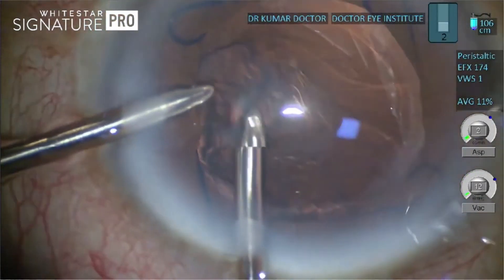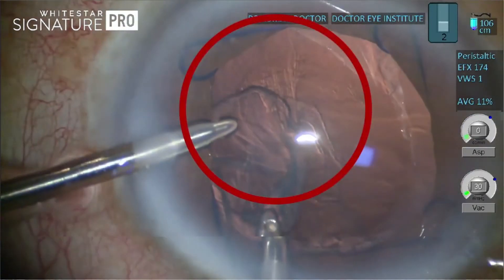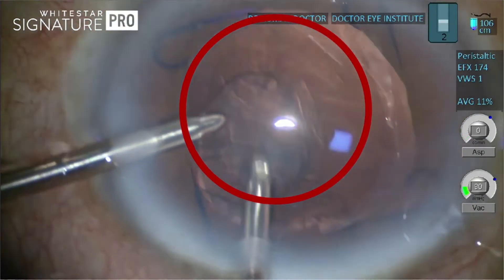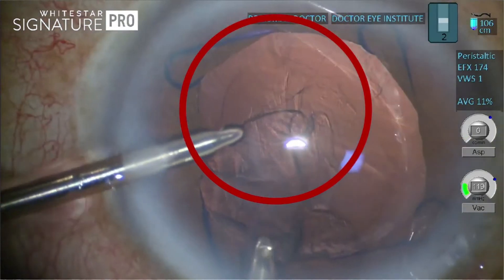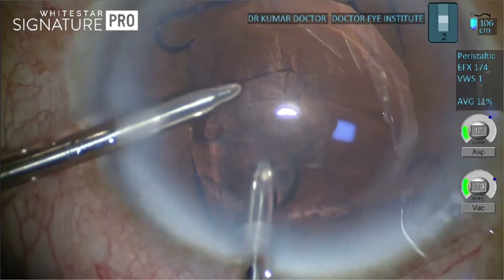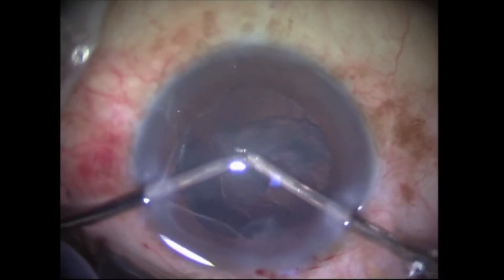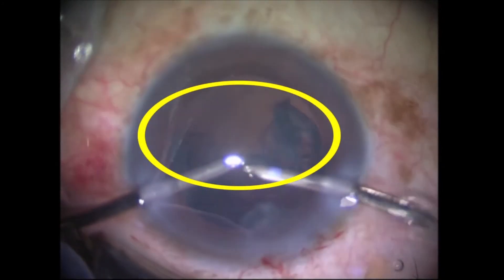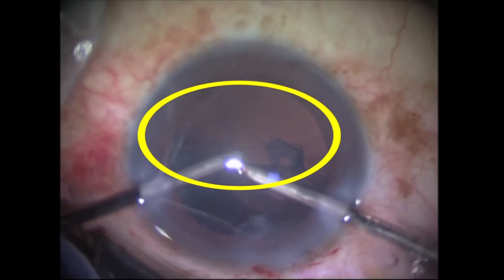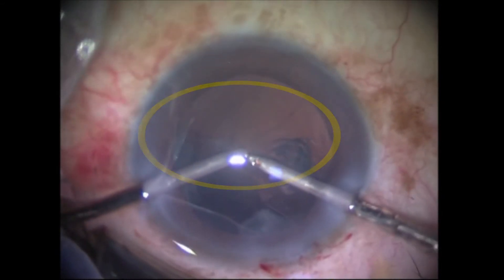If the posterior zonules are weak, note how the posterior capsule follows the aspiration probe as the cortex is stripped off. Once the cortex is stripped off, note the fluttering of the lax posterior capsule, indicating weak posterior zonular support.